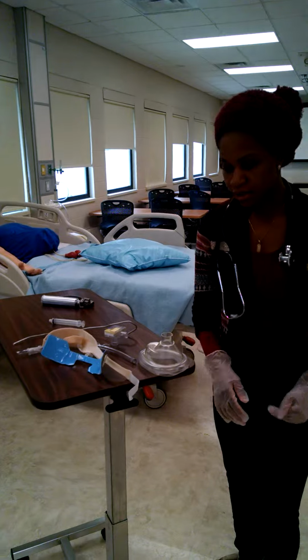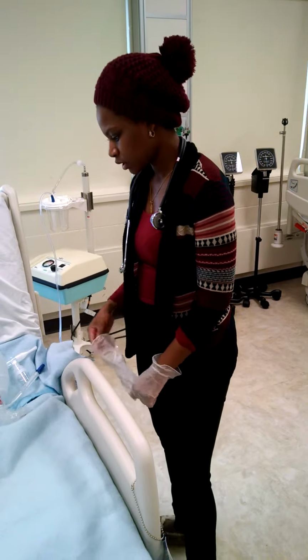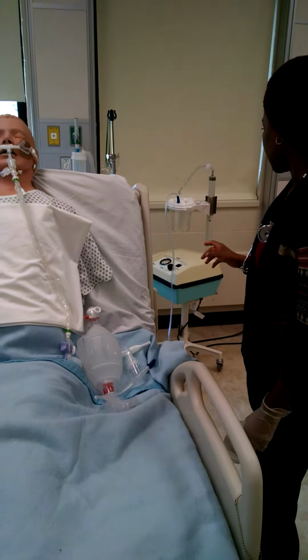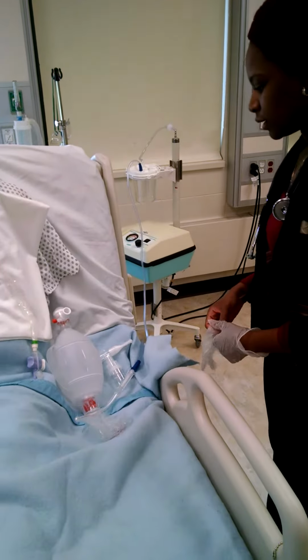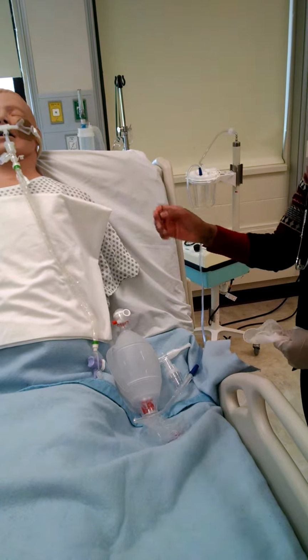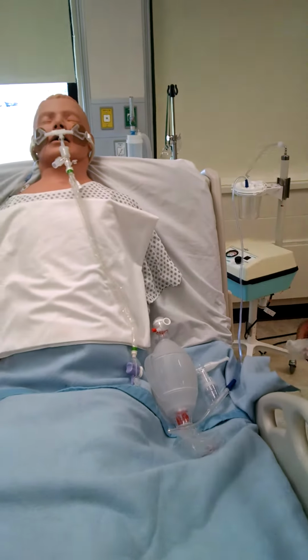Okay, I've also gathered my belongings for extubation, which includes my manual resuscitator, my vacuum, which is set at -120 to -150, my oxygen source, my aerosol mask, my closed suction catheter, my 10 cc syringe, my pulse ox, and I also have a chuck on the patient.